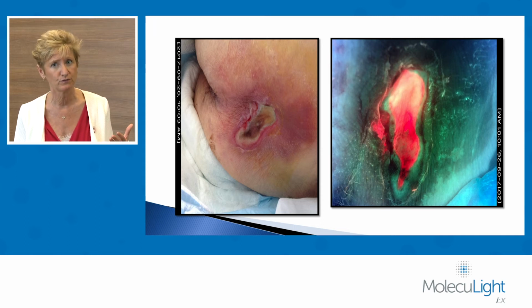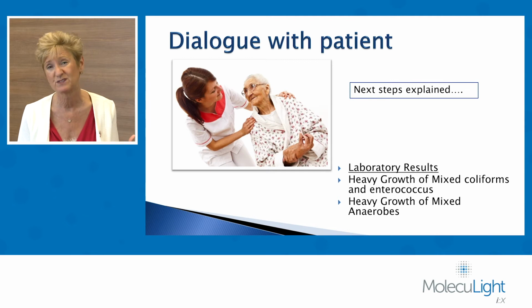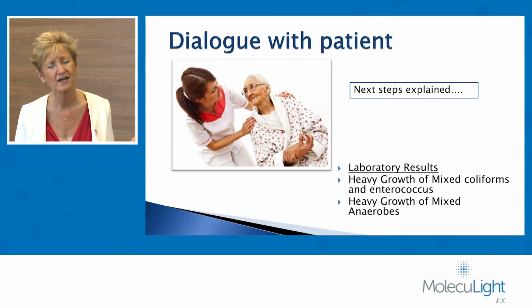And actually, we cultured, and of course, it was very heavy, a heavy growth of mixed coliforms and enterococcus, and then there was a heavy growth of mixed anaerobes. And we began a new treatment plan. And we took time to talk to the patient because she was really keen to move to an area that was less acute care focused.